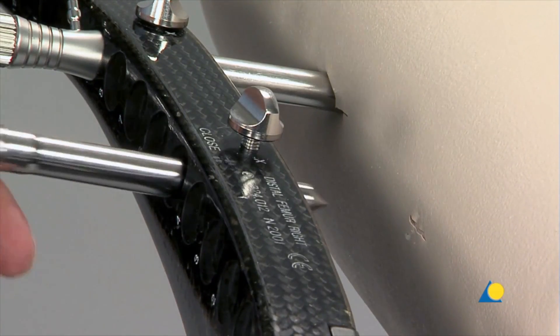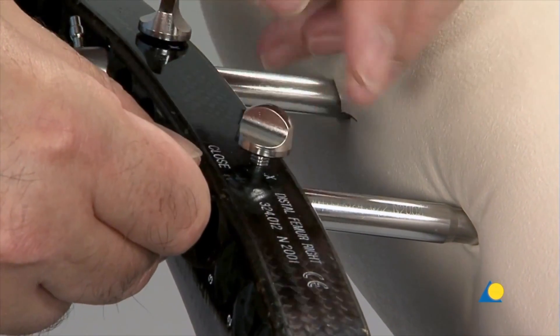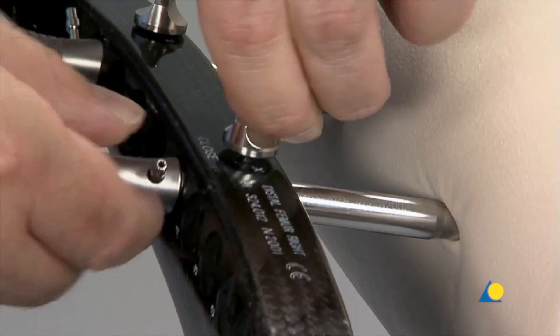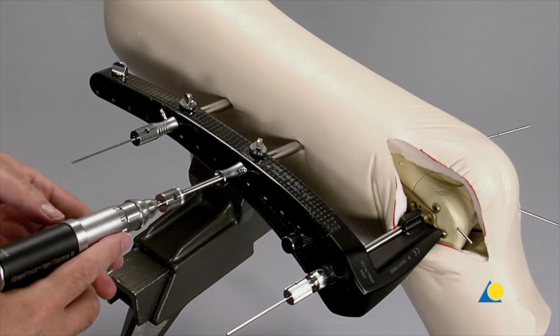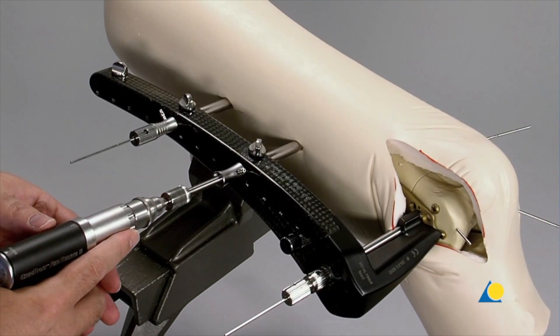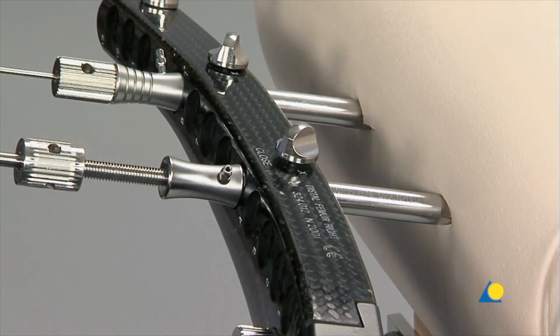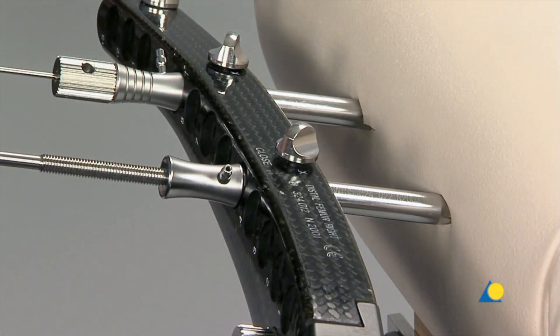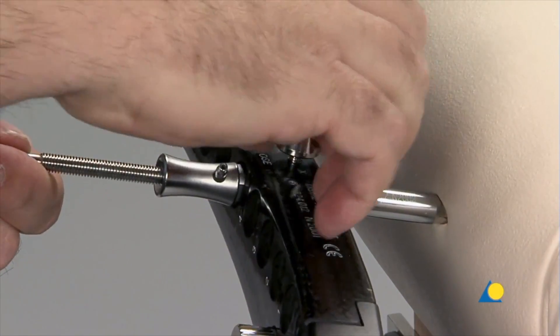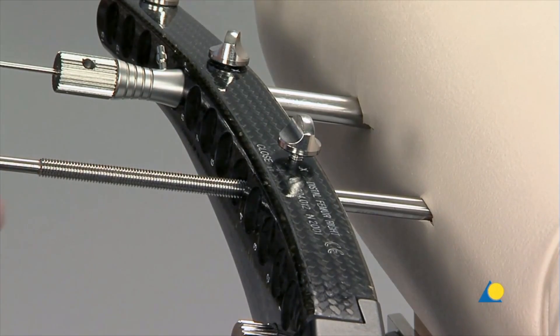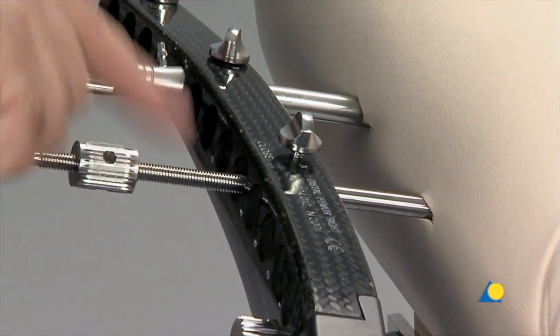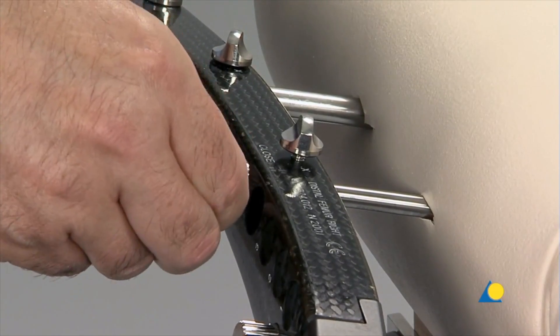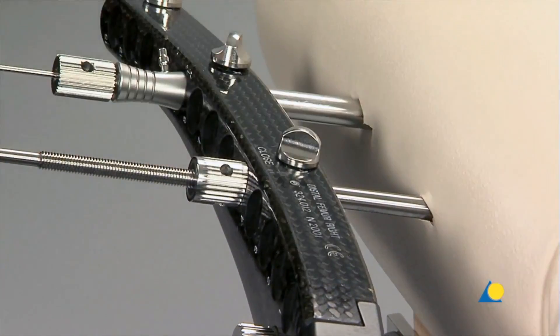A pull reduction instrument will be inserted through hole 5 to stabilize the bone against the plate. A stab incision is made and the insertion sleeve introduced in the usual manner. The pull reduction device is inserted monocortically with a power tool, although in osteoporotic bone, it should be used bicortically. The nut is taken away to allow the insertion sleeve to be removed. The nut is then put back. To fix the distance between the shaft of the femur and the plate, the nut is tightened down to the insertion guide, first by hand and then with a pin wrench.